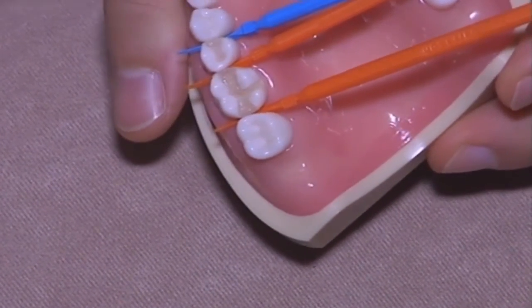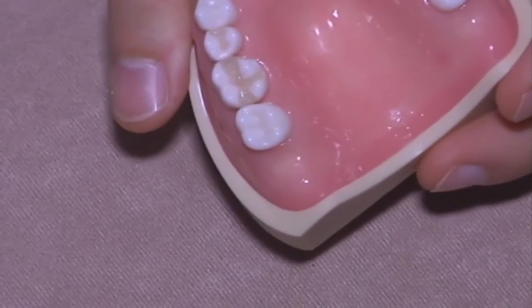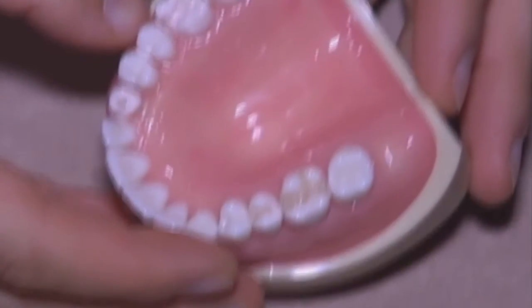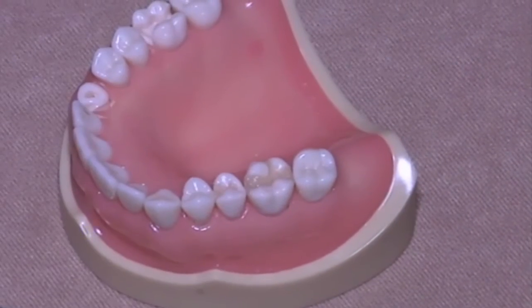And we have the dentin shades. I can remove this. I think it will not bleed. And now we're gonna miss just the enamel.